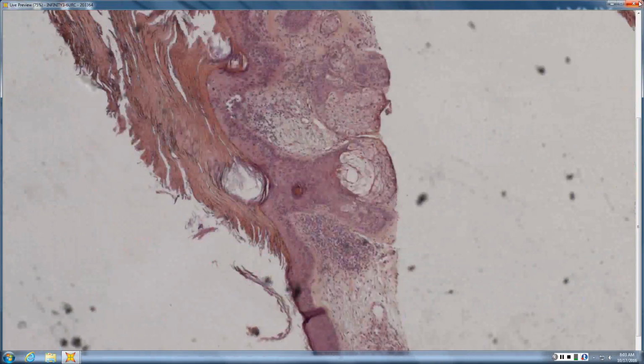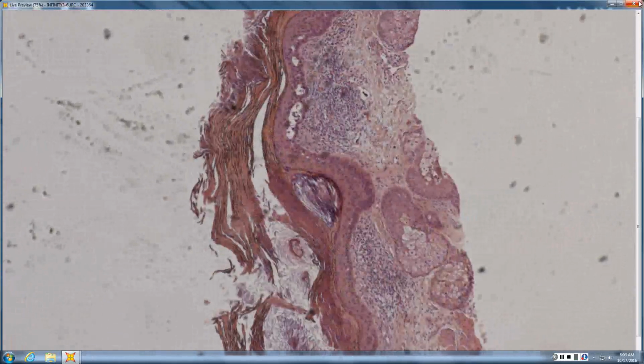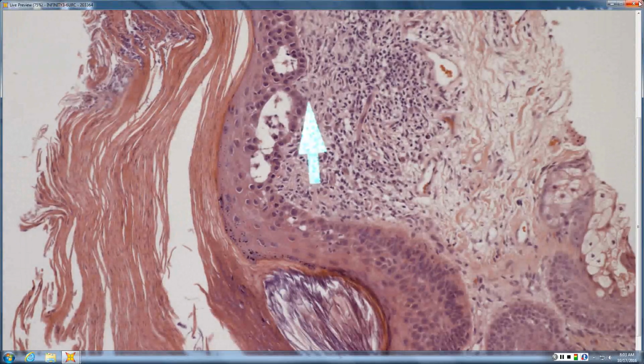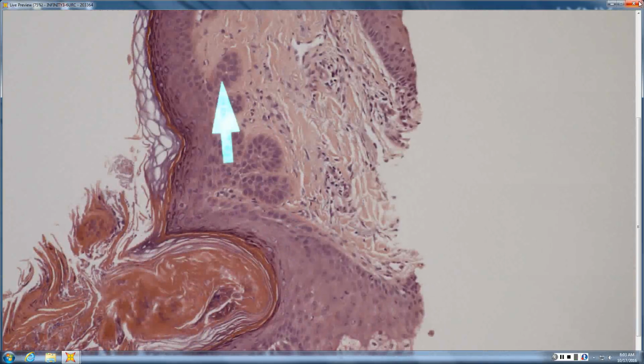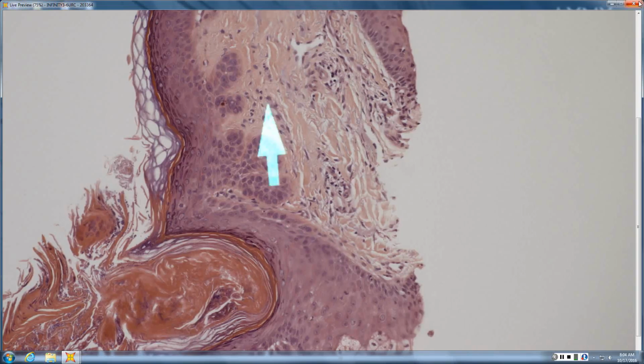Some big shave biopsy. There's a prominent horn, kind of loose, flaky. There's a couple areas in the epidermis with intraepidermal blisters or spaces. Maybe some acantholysis. Some larger epidermal cells. That looks like a pilar sheath acanthoma a little bit off the hair follicle, or large cell acanthoma, maybe. So there's certainly large cells, composed of large cells budding downward from the epidermis, extending along the outside of hair follicles.